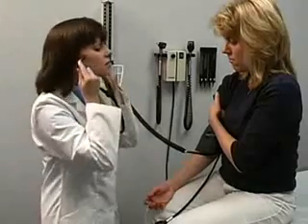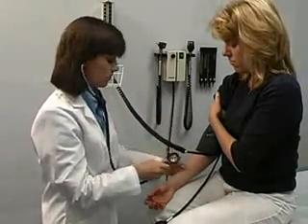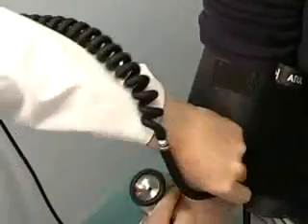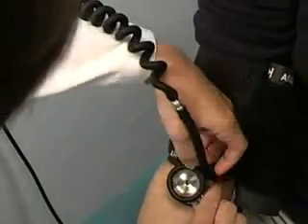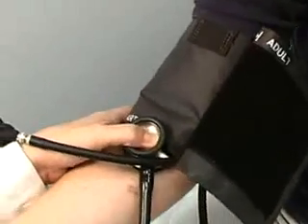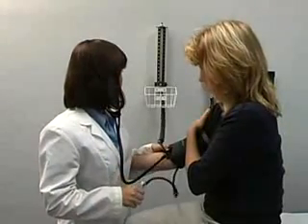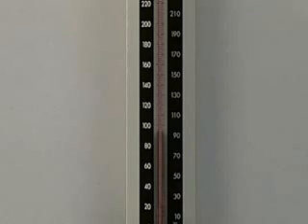Select the proper cuff size and correctly place the cuff on the patient's arm. Using the diaphragm of your stethoscope, place it over the brachial artery. Support the arm at heart level. Inflate the cuff 30 millimeters of mercury over the estimated systolic pressure. This avoids an unrecognized auscultatory gap that may lead to serious underestimation of systolic pressure.